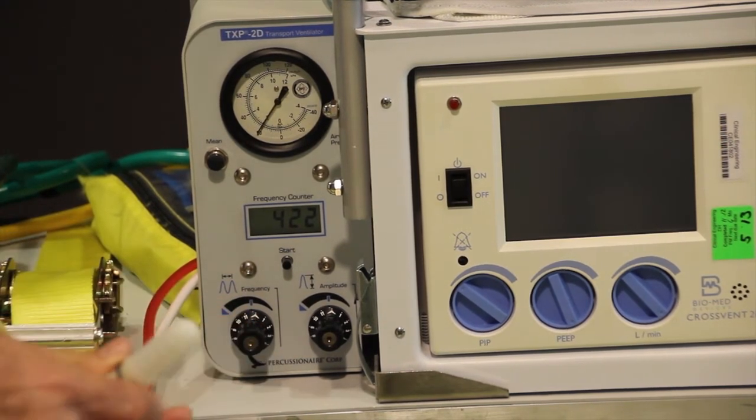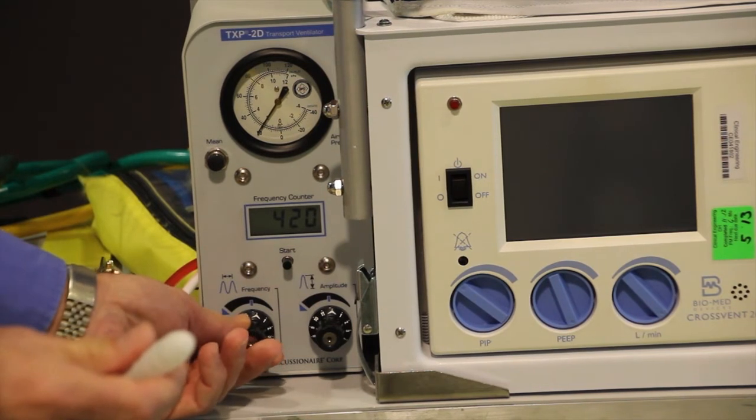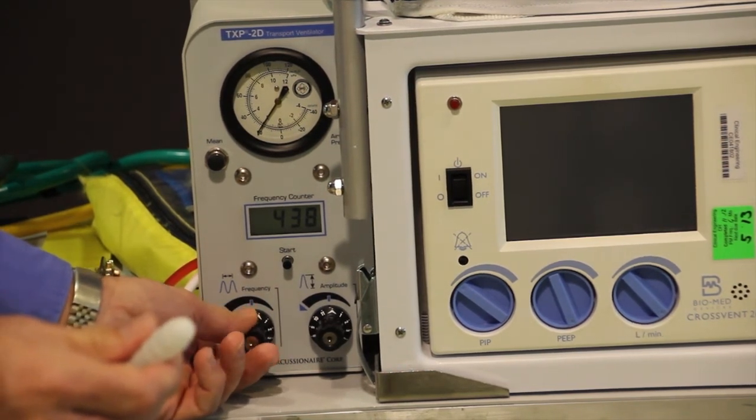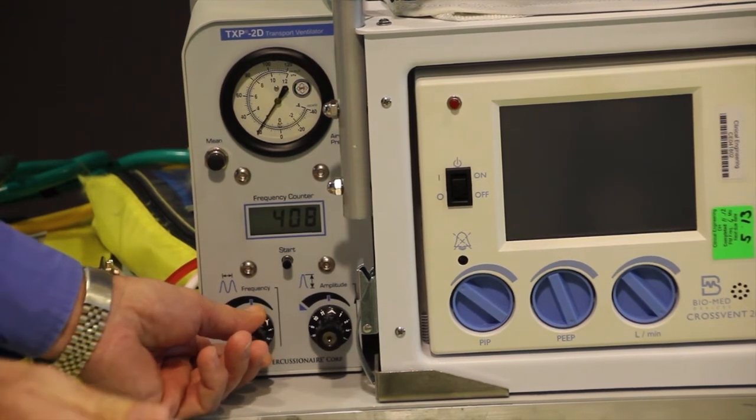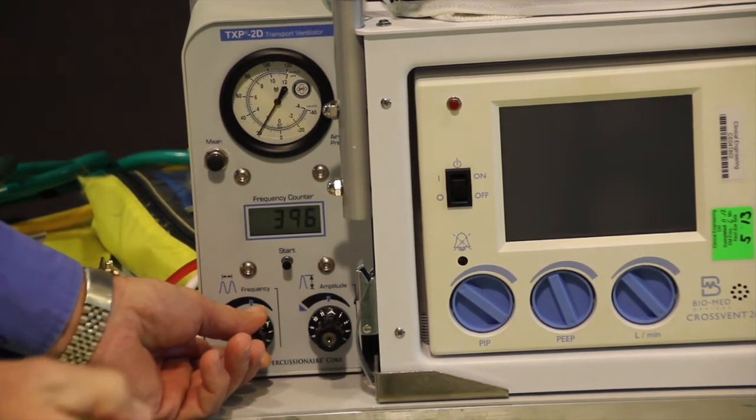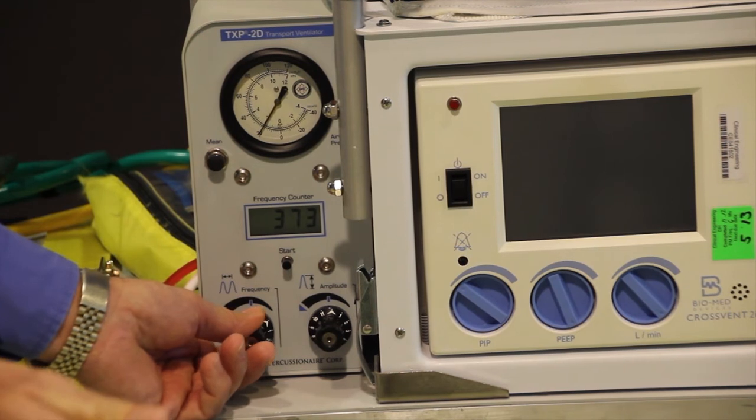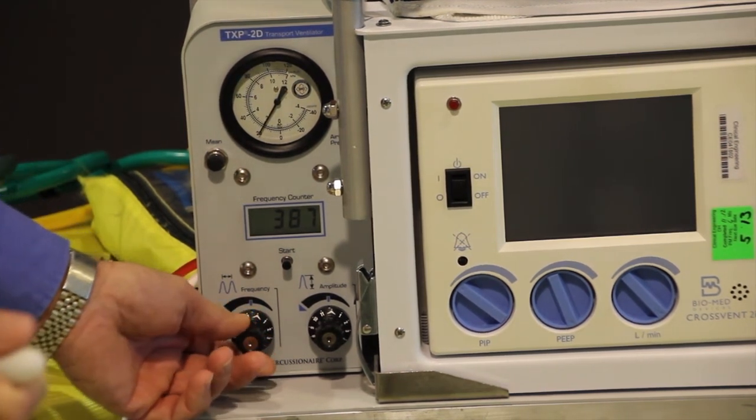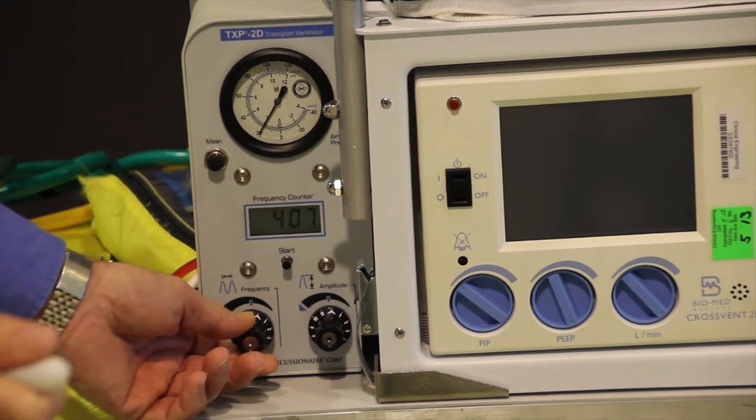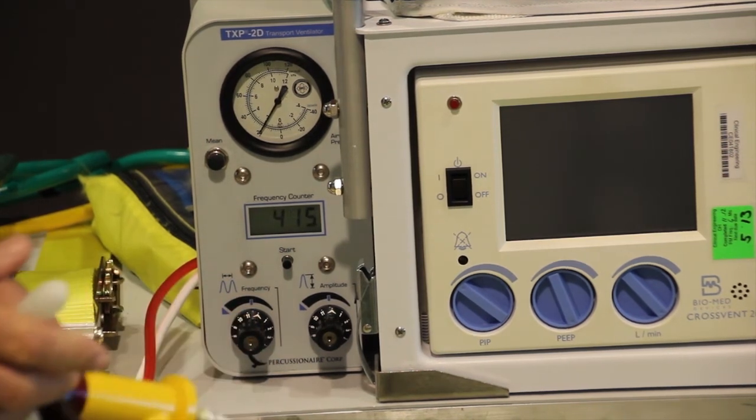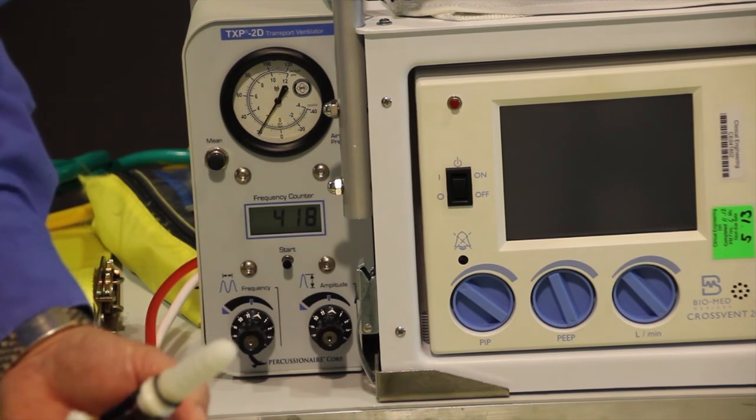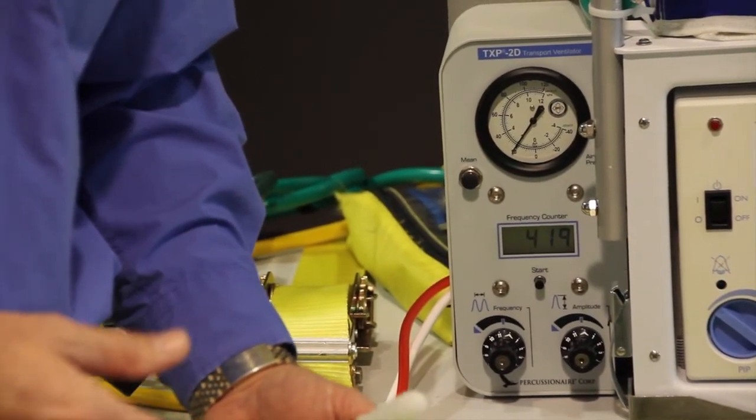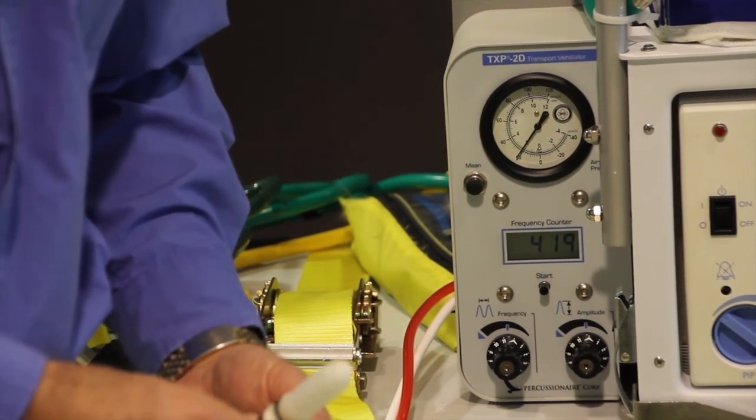I'm going to drop my frequency down just a little bit, and as you can see right now it's increasing the amplitude. So that's kind of a quick version of how to use the TXP. In addition to that, we have a setup guide for different disease processes that we'll follow, and we'll cover that in more detail later. Thank you.